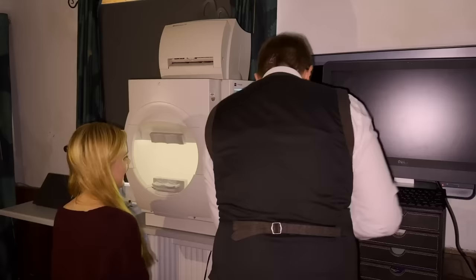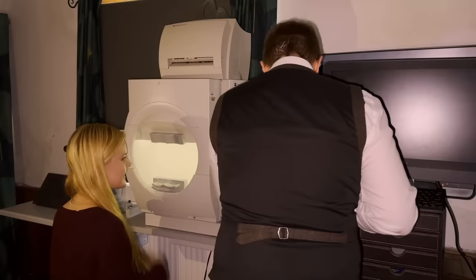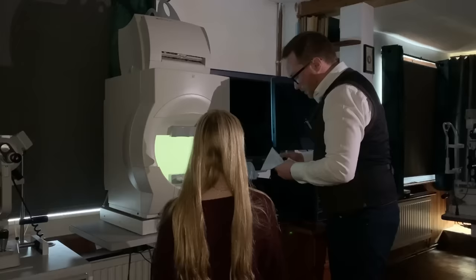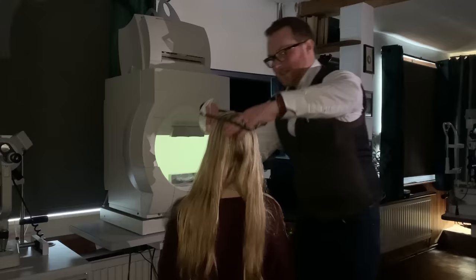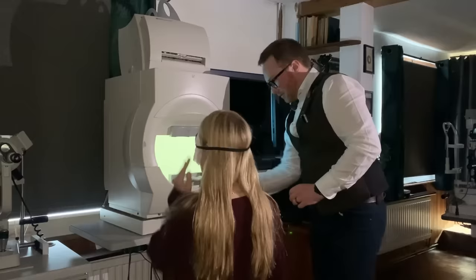Now, you get to dress up like a pirate with this one. We've got an eye patch. We'll just grab that out of the UV cleaner. I'll cover up your left eye to start with, test one eye and then we'll move over to the other eye. Okay, is that comfortable there for you? Yeah. Okay, I'm afraid the wooden leg and parrot are an optional extra.